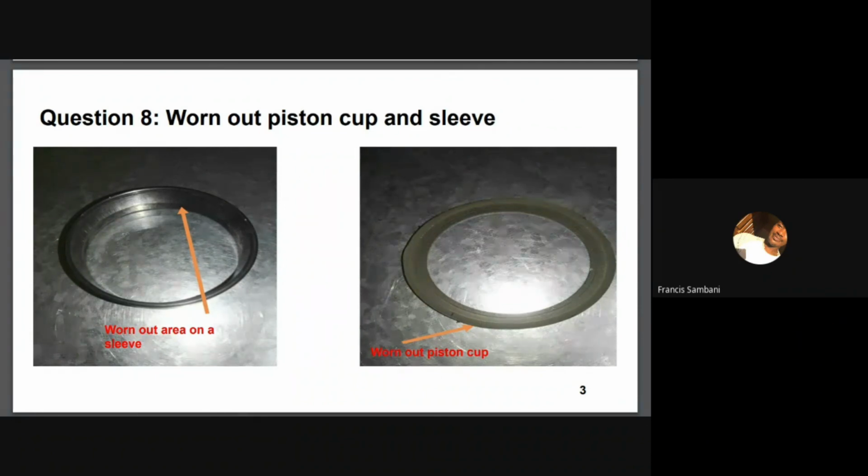After you've fixed the compressor, you don't go straight to refilling the sieve beds, but firstly test it to see the performance, because sometimes it is possible that the zeolite is just okay, and what was failing was the compressor itself.